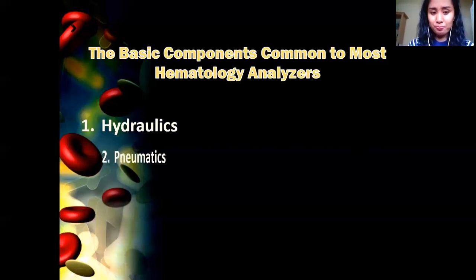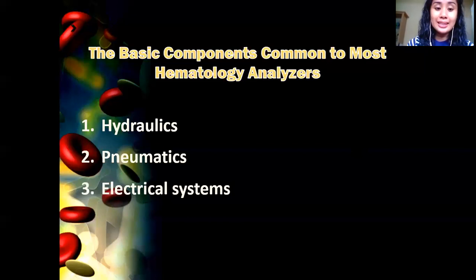So class, there are just three parts of your analyzer. Very easy. Hydraulics, pneumatics, and electrical system. So we just want you to be aware of it. Ma'am, pag nasira pa yung analyzer, inaayos natin? Class, actually, there's a technician for that. But as a medtech, we need to know how to troubleshoot. Example, the use of printers, ganyan, or the use of your phones. Isn't it that pag naglalag na, nire-restart mo na, ganyan, or i-check mo kung anong mga kaya mong ayusin, something like that. So, ganun, we troubleshoot.